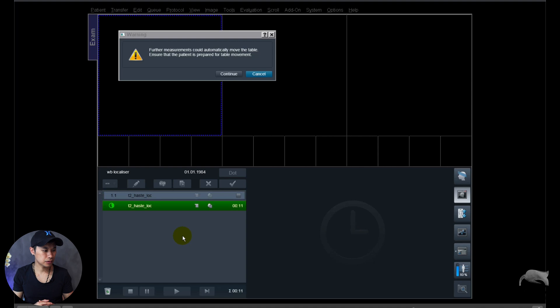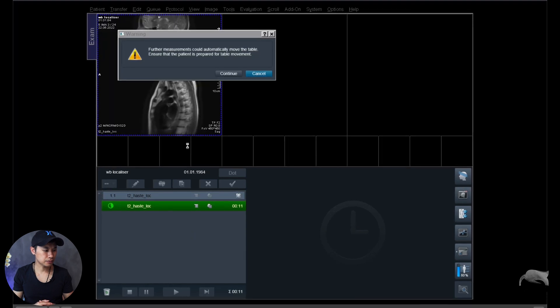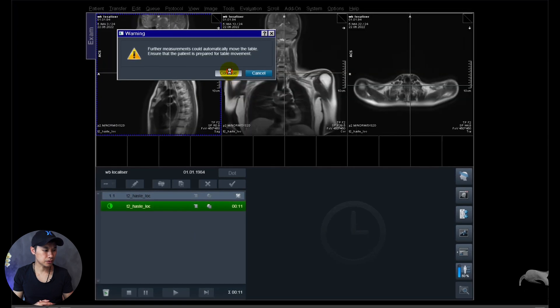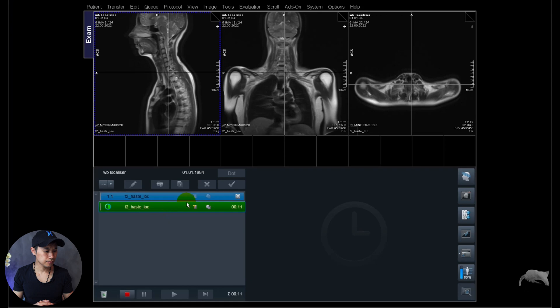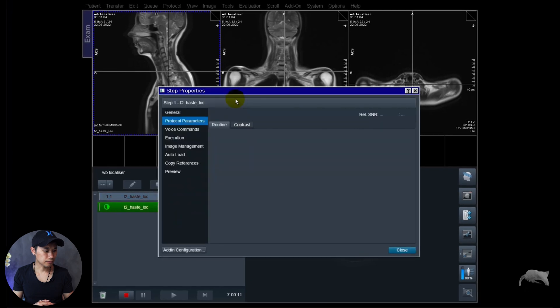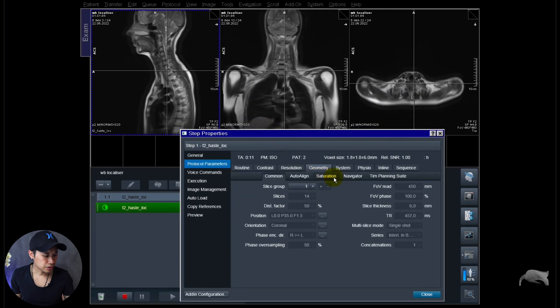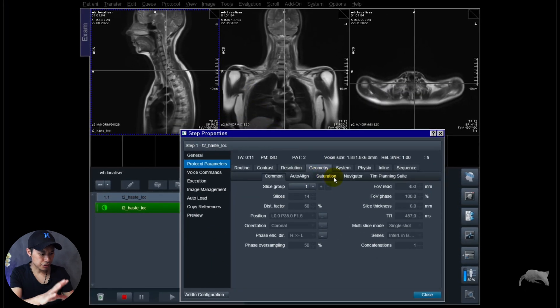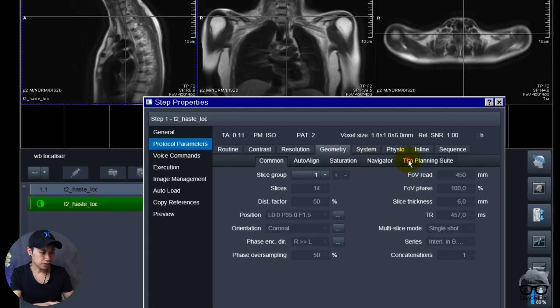We're just going to delete that one and we're going to drag it over and it will run automatically just as what we want a localizer to be. And let's run that one and see if it works. So first step is finished now, we're just going to continue.